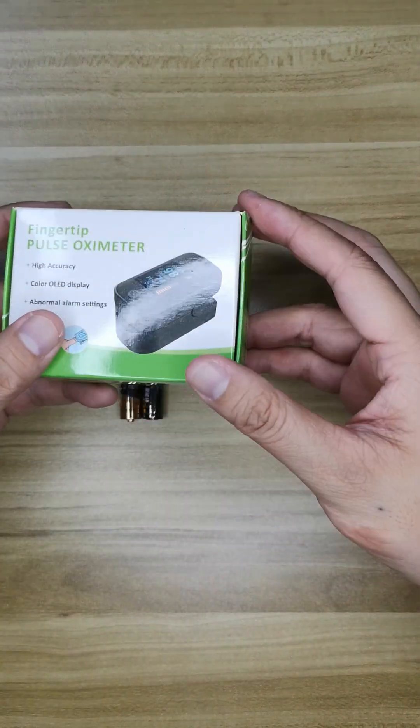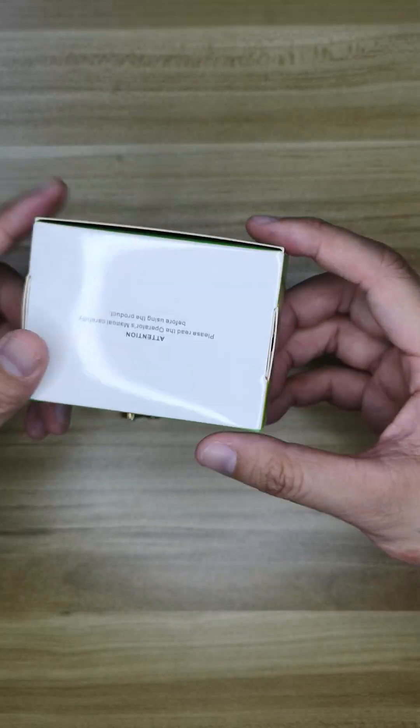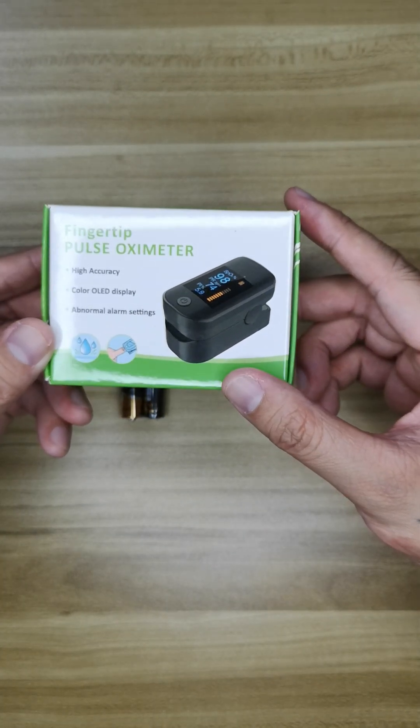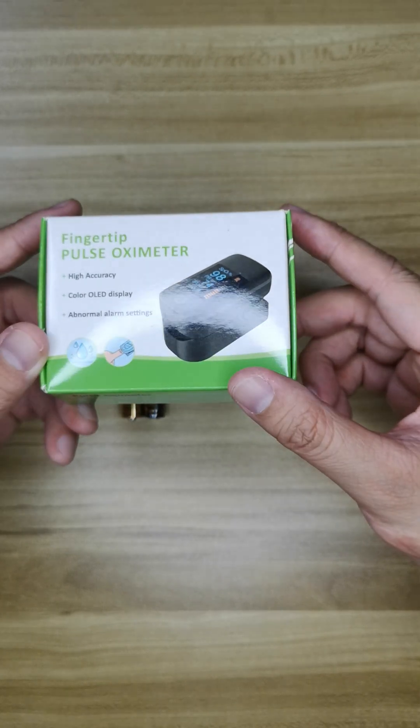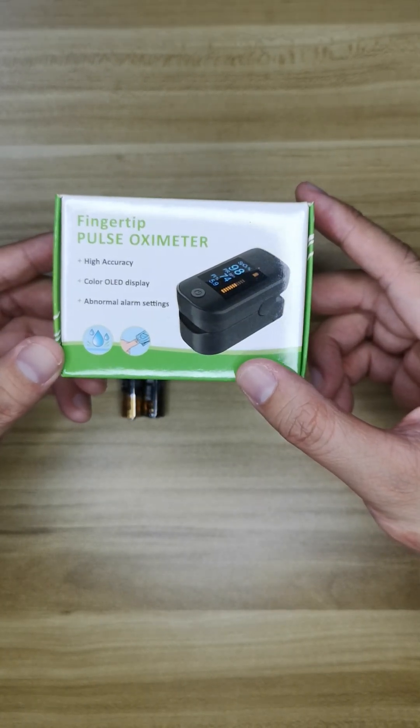Hello, today I'm going to introduce our product. This product is a fingertip pulse oximeter with high accuracy, a color OLED display, and abnormal alarm settings.